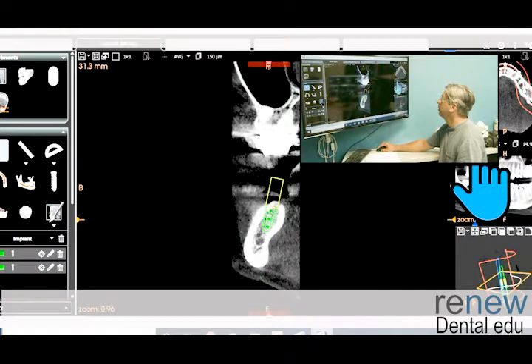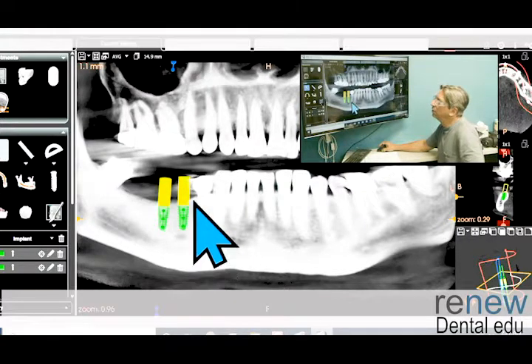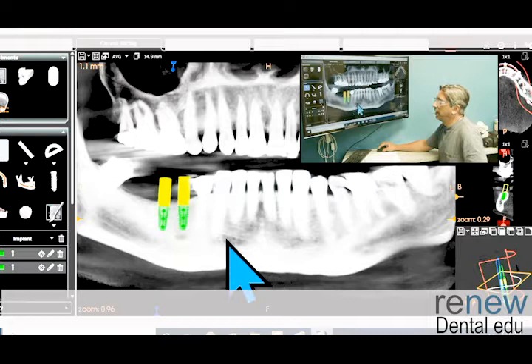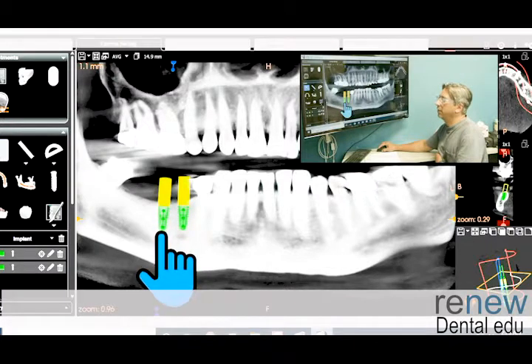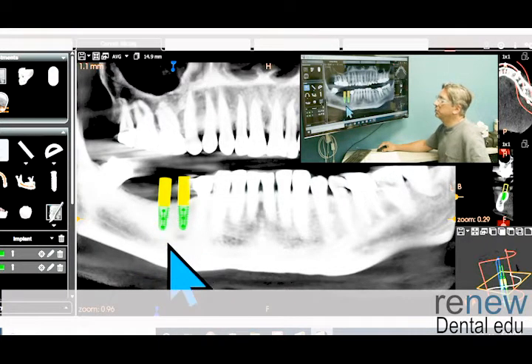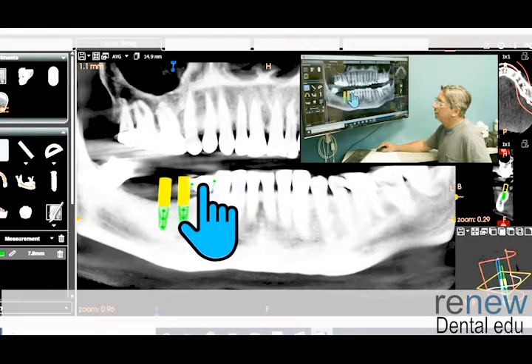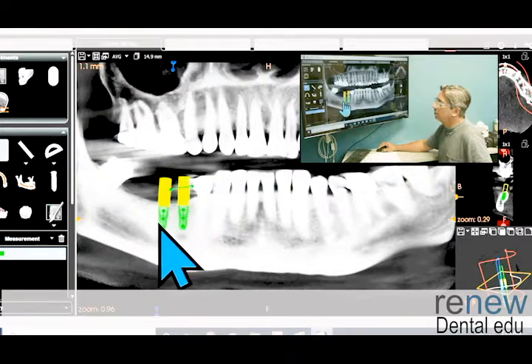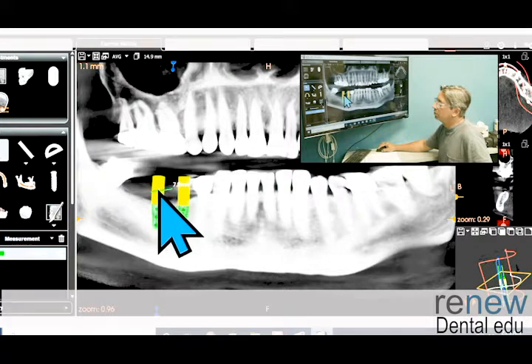Now, I always get the question of, do you splint or not splint? And it's case by case, my answer. And so I would not splint this case. I would make sure they could be cleaned. But I wouldn't put a full giant molar tooth here. I would limit the molar just a hair because it is a 4.2 diameter. I'd like to see a 5 at least here in a molar position, but I would leave it as more of a premolar size, which, if this is the premolar size here, I think that's totally fine. You're going to be one here, and actually maybe this even goes back further. I was just guessing there, and you would stage it something like that.